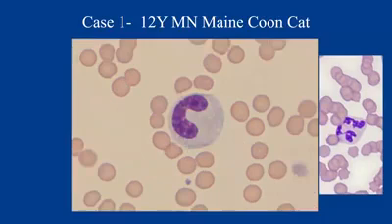Here is another white blood cell. It looks different compared to this neutrophil. It definitely has that cytoplasmic basophilia going on, so toxicity, and it also has a little bit of foaminess to the cytoplasm, which is another indicator of toxic change in this patient. But then you can also see that the nucleus is U-shaped or band-shaped. So this is a band.